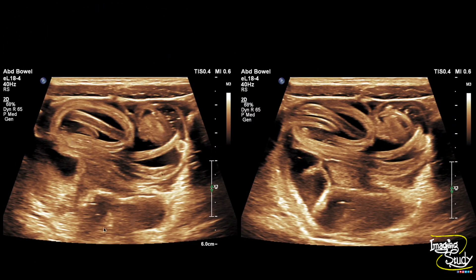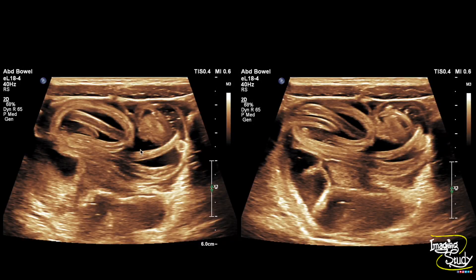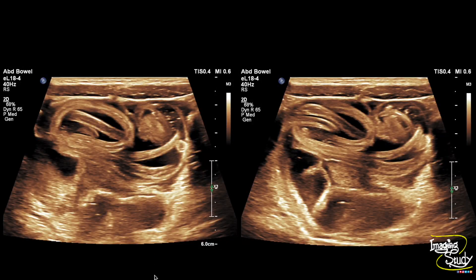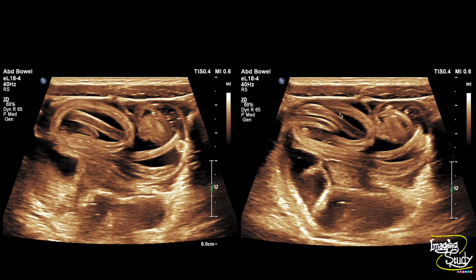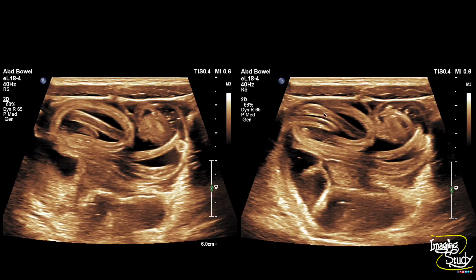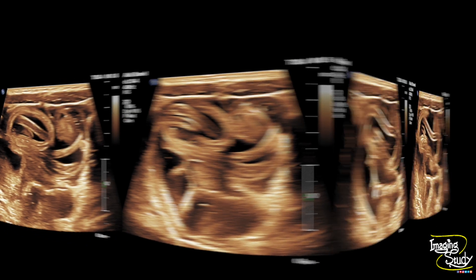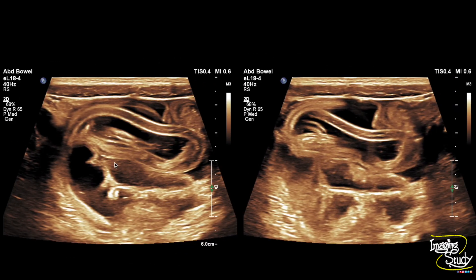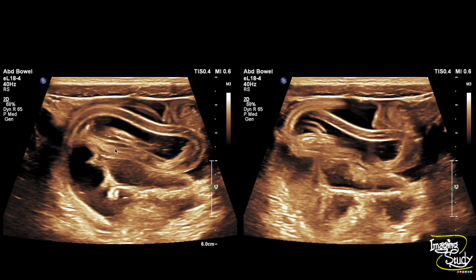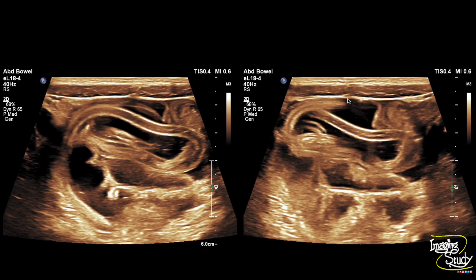Here you can see the small intestinal loops are fluid-filled and distended, and you can see a lot of worms within the lumen — they are almost occluding the lumen here. You can also see multiple echogenic worms within the intestinal loops.